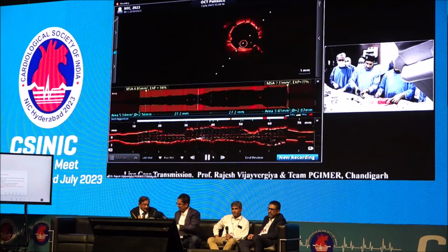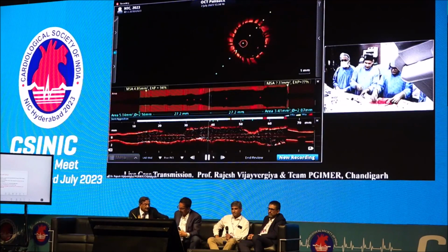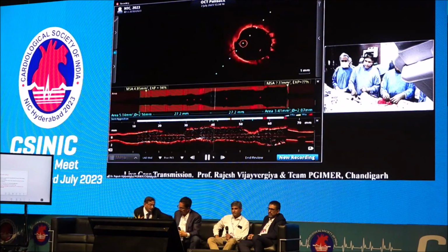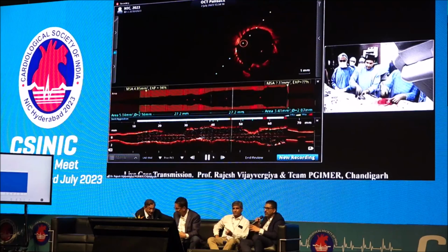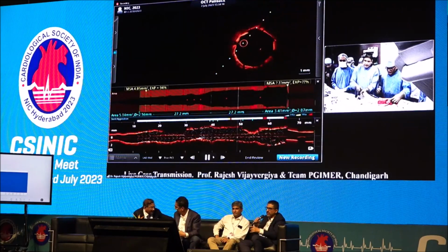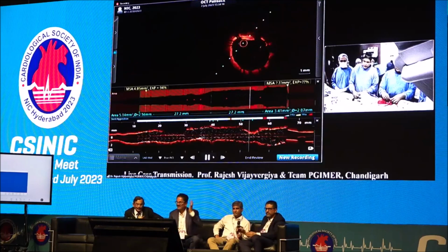Inflate. Negative. Inflate. 18. I think you can show us the live what you are doing. We can see the OCT. Okay, just a minute.